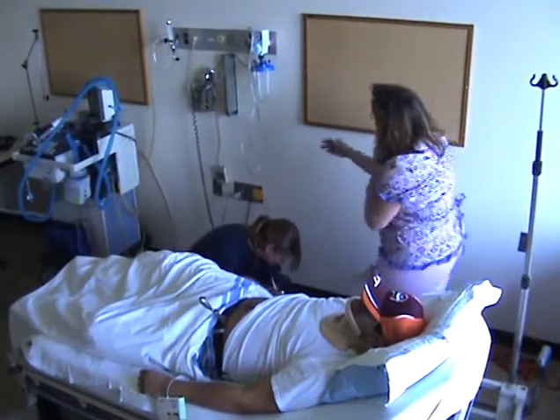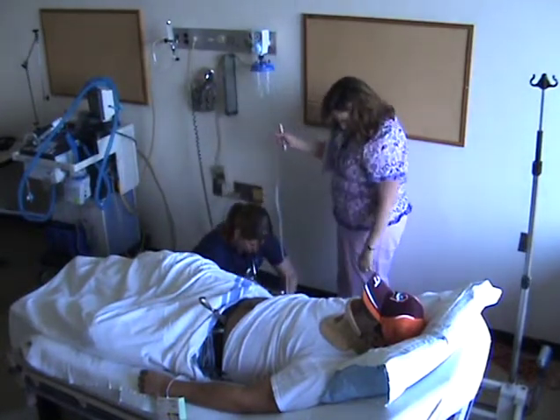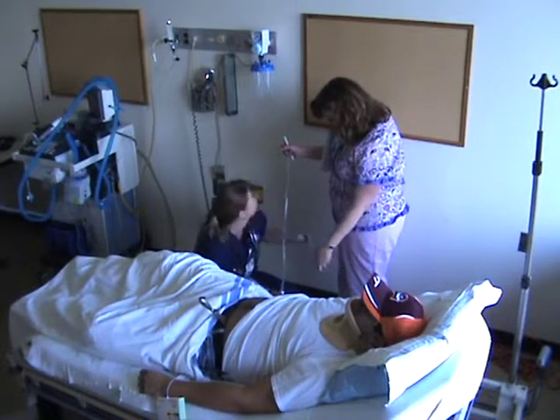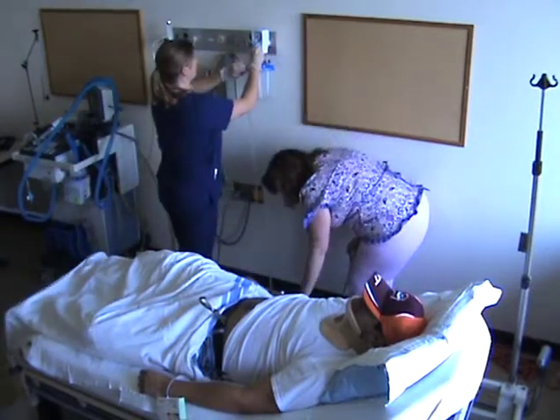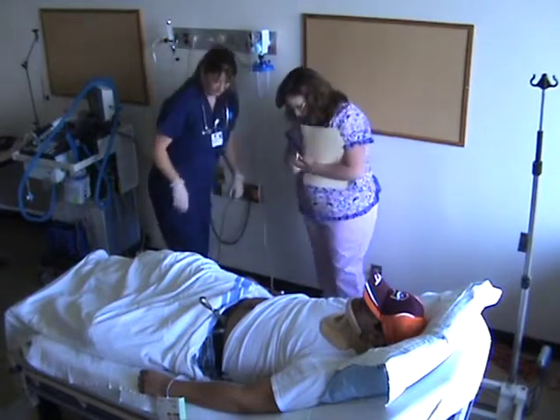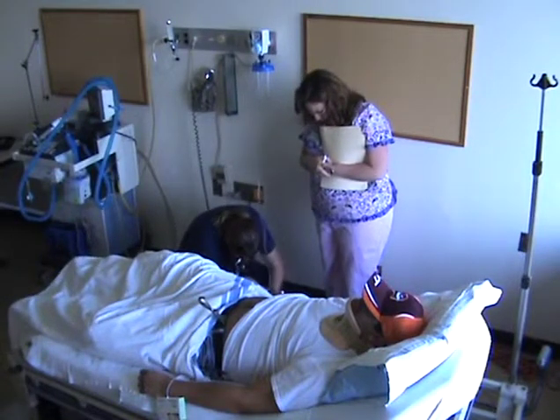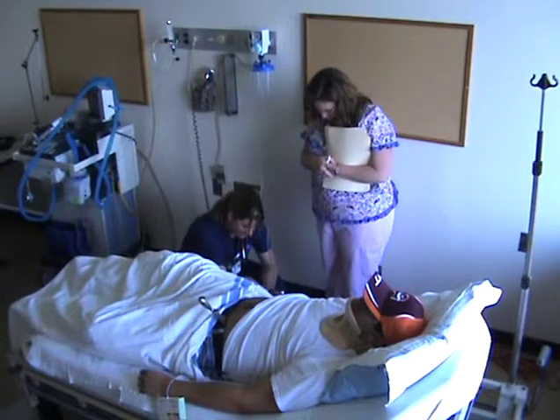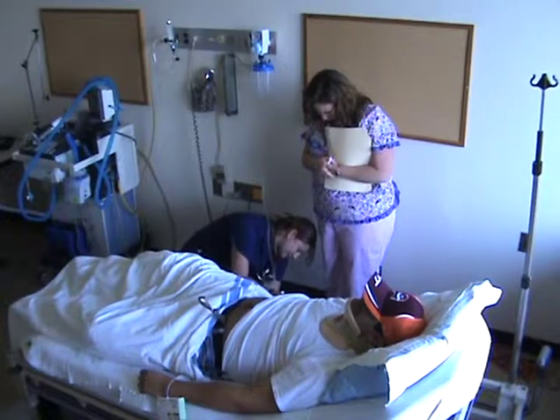We've got our suction tubing here. That would go, yeah, and then we would set it at about 20. This is the dry one, so we dial it up just to where we see this. I don't think it's actually going to bubble, though. The suction's not even set up in the room. So, show me what else you need to do when you're setting up your chest tube. You need to secure it to his body with tape and make sure that there's a good seal. Yep. And then you need to check the water here, if it's bubbling, because if it is, then you probably have an air leak.